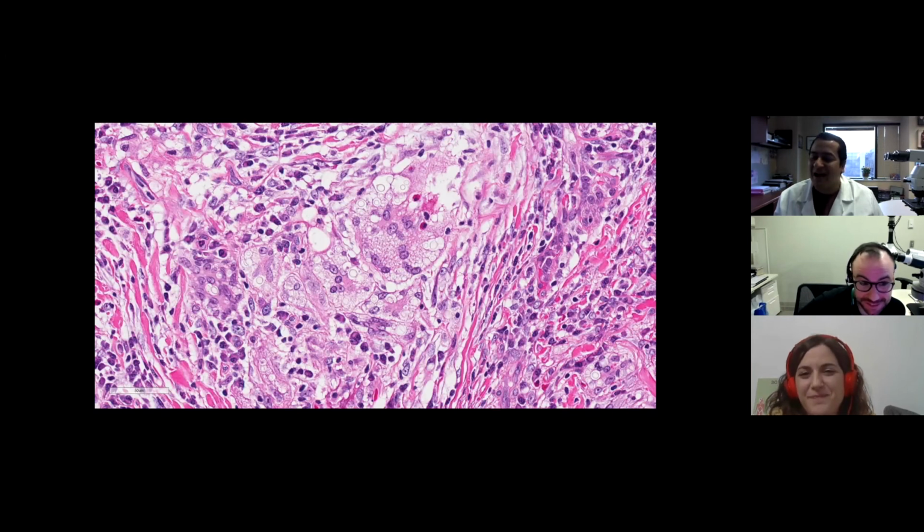Matt, do you want to add anything to this? What makes you think of Cryptococcus when you see an H&E? That you can really nicely see the cells on the H&E, right? You're not really struggling to see them. They really pop, and that always makes me think of it. And then there's a fair variability in size, right? You have some smaller ones and you have some big ones. Pleomorphism, yeah. I think that can be a soft sign as well, the pleomorphism in size.